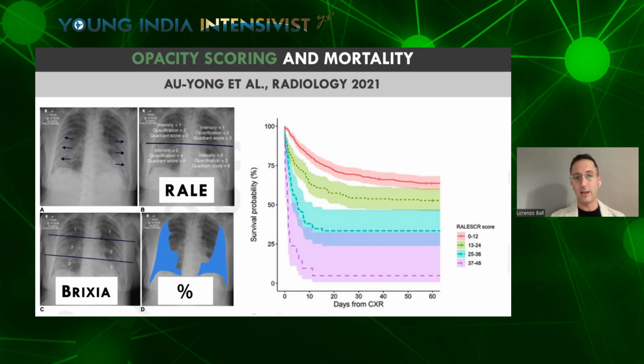So simply looking at how white my chest X-ray is and trying to quantify it, not only stating this is a bit better than yesterday or worse than yesterday, trying to give numbers to our chest X-ray allows us to understand which of our patients is at a higher risk of dying during the ICU stay. I already mentioned that the last method, the estimation of the percentage of opacification in the chest X-ray, is made automatically in many of the contemporary machines we use to acquire chest X-rays at the bedside.